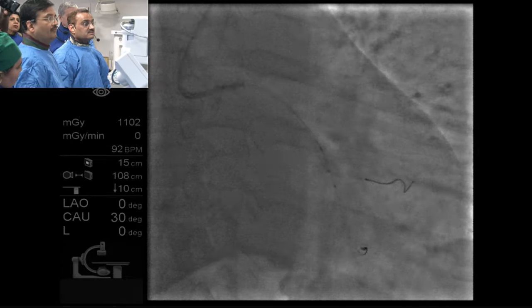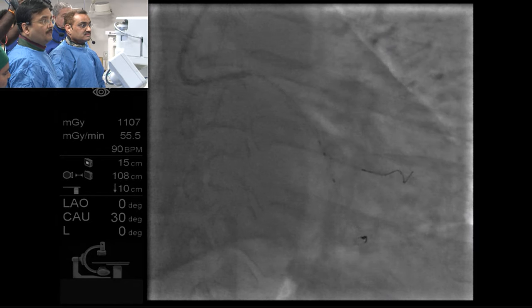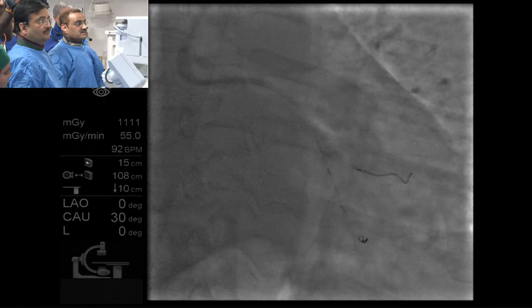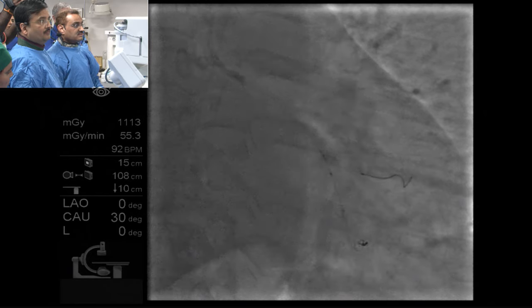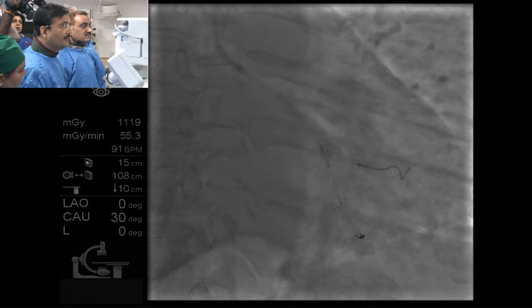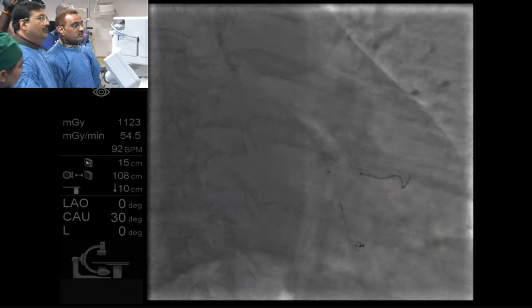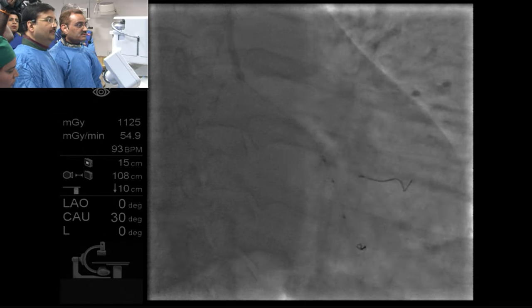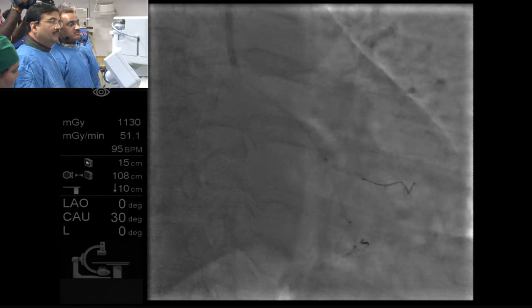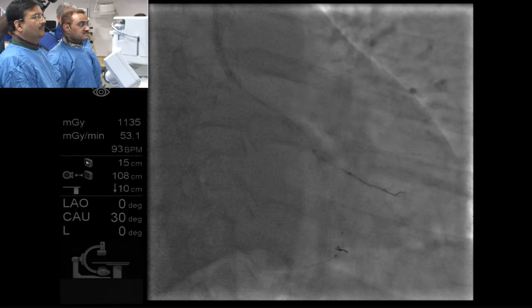And then now, pull the whole thing out. Not yet. The guide is deep throating. So you deploy the stent now. Right? And what is the next step? Next step is I'm just going to pull the balloon and wire out of there. He's pulling out the stent delivery balloon and the wire in that circ OM. The guide is deep throating. Why do you pull the wire again? Chris is planning to crush that now.